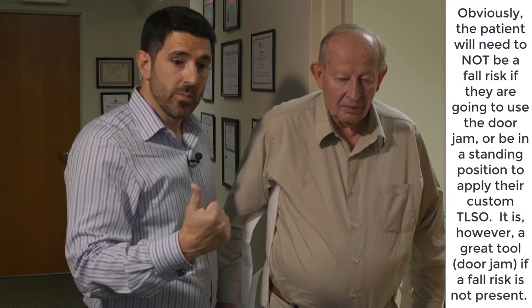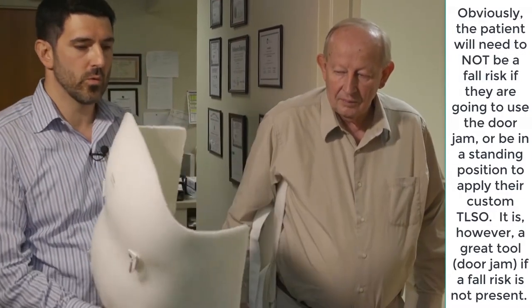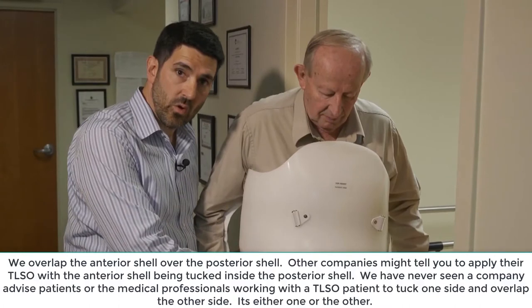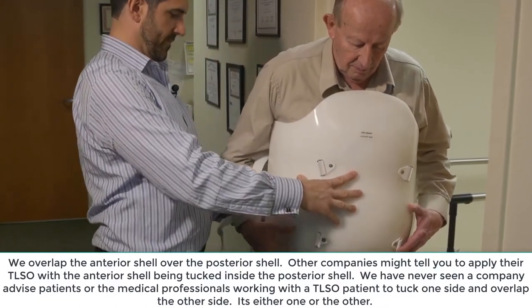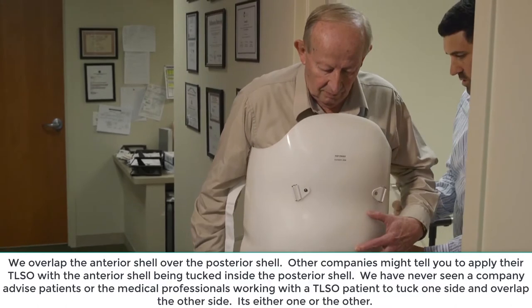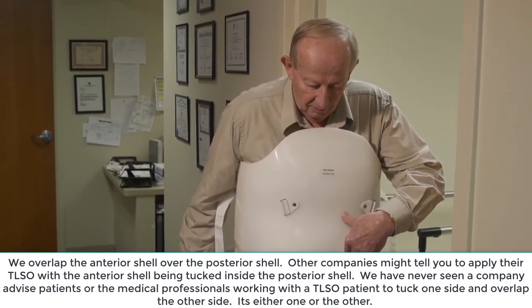Some other places might tell their patients to do it differently — we can't speak for everybody, but this is the way we show people how to do it. I'm going to grab the anterior portion of the brace. Here's the anterior shell, and the way we do this is that it goes on over the top of the back piece, and we try to line up the waist grooves when we do that. It's meant to feel like it's giving you a hug, so you're going to feel that now. If it's too much, just let me know.